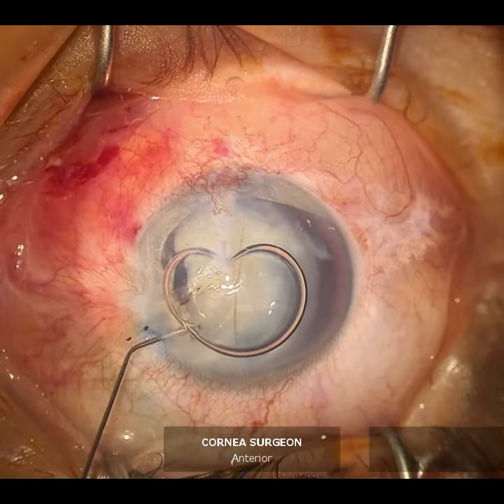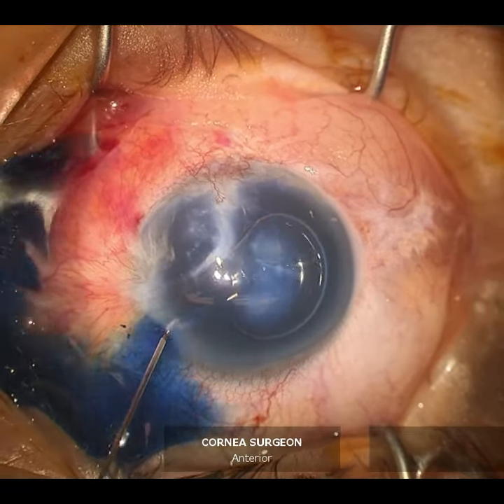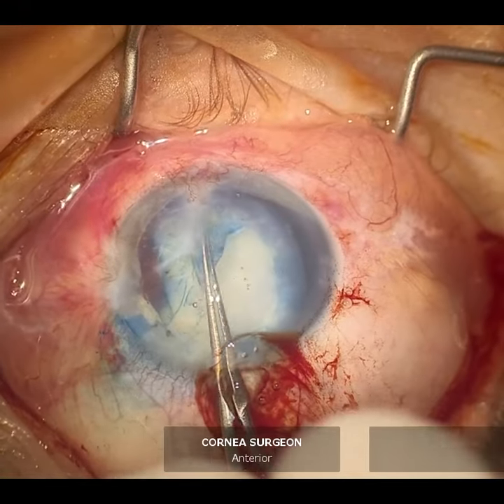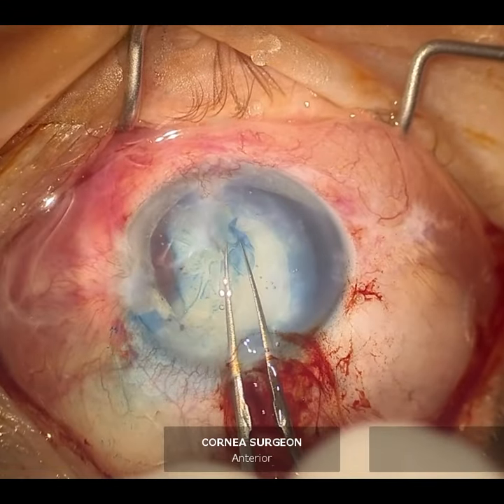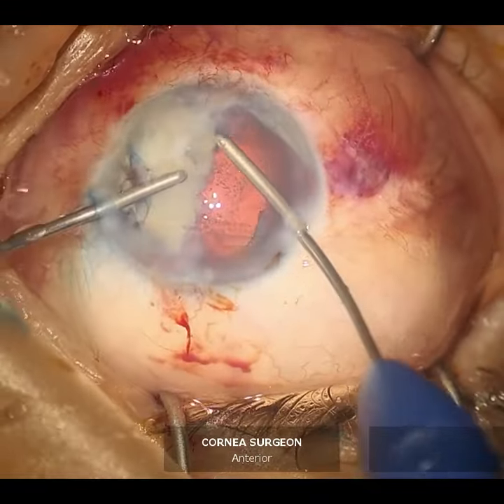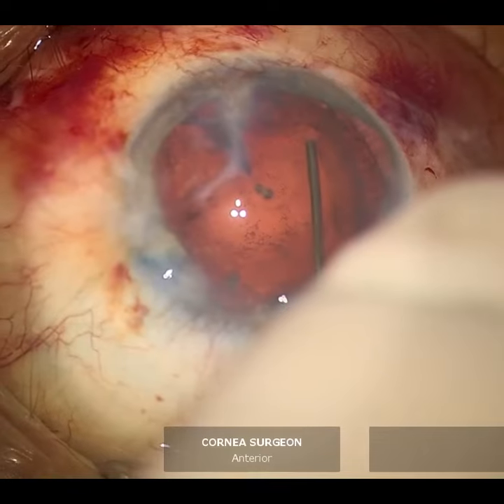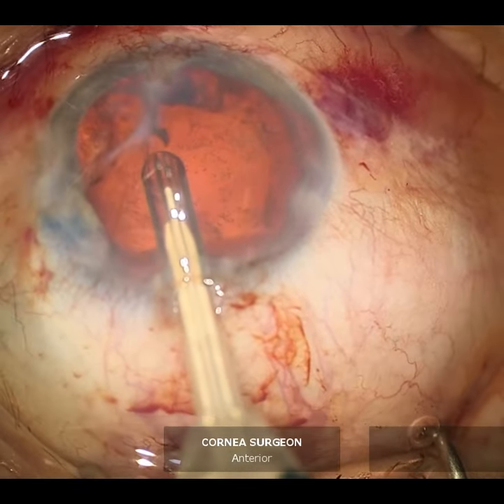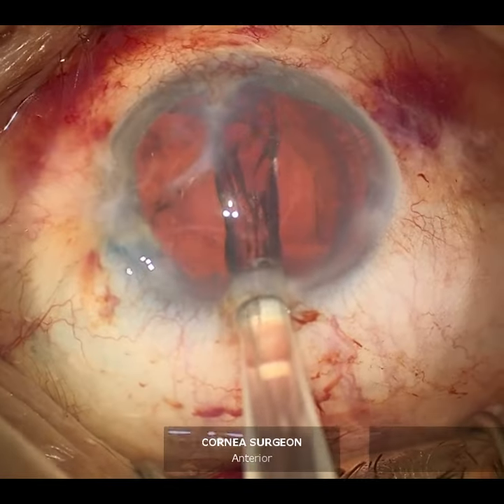This is a case of traumatic iris loss and cataract. The cataract was removed keeping the capsular bag intact. A capsular tension ring was inserted followed by an intraocular lens implant.